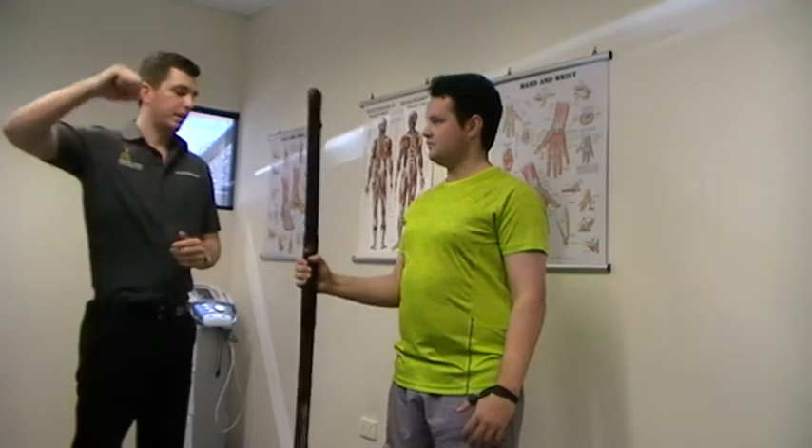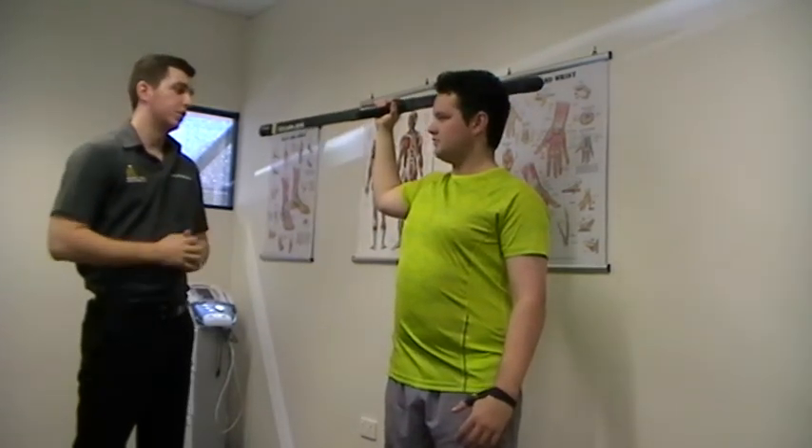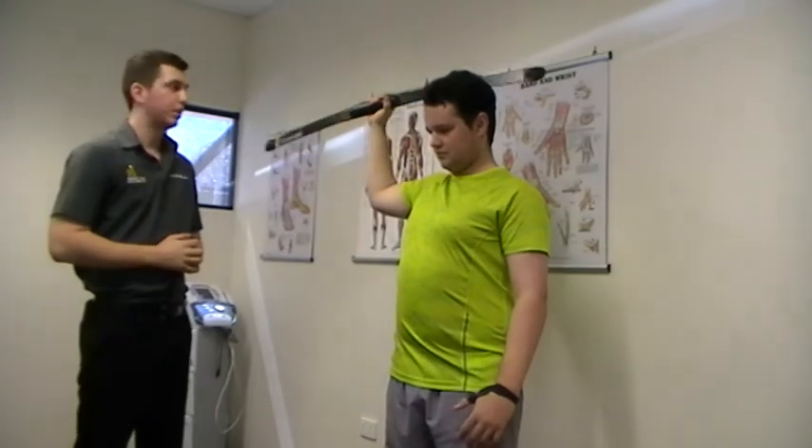Now Jordan, take it out to your side a little bit. We can increase the intensity of the exercise by doing this as well, and we can make it a lot harder for Jordan.